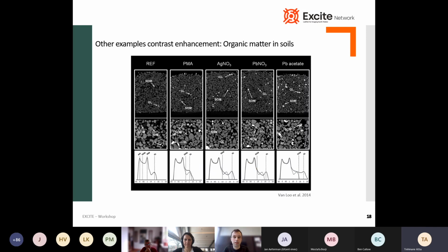Another example, which is quite common in geology, is to distinguish organic matter in soils. Here on the left, you use no contrast agents, and as you see, it's very hard to distinguish the soil organic matter from the surrounding air. The other phases which are visible are the minerals and the glauconite. When you use a contrast agent, then you can increase the attenuation of the soil organic matter, and it becomes brighter, which is also visible in the attenuation graphs of the different phases, the grayscale of the image. It's also important to take into account which contrast agents work best for what you're interested in, because you can easily increase the attenuation of soil organic matter, but you have to make sure that it doesn't come too close to the gray value of the glauconite, otherwise you create other problems.